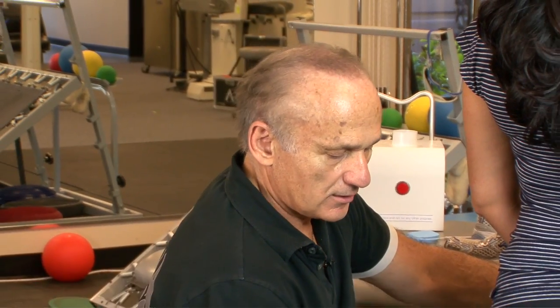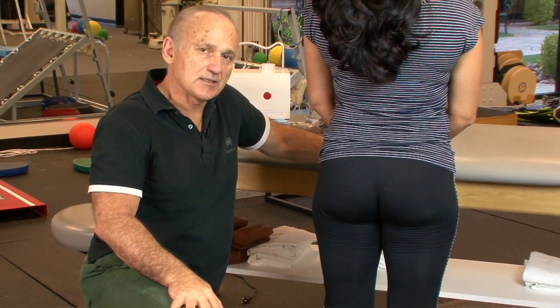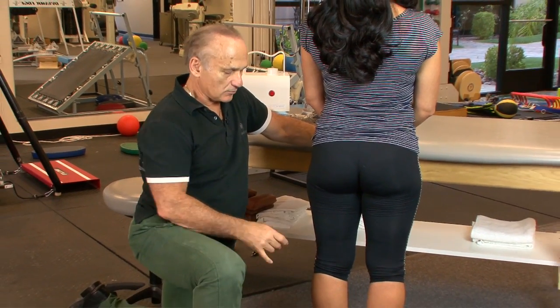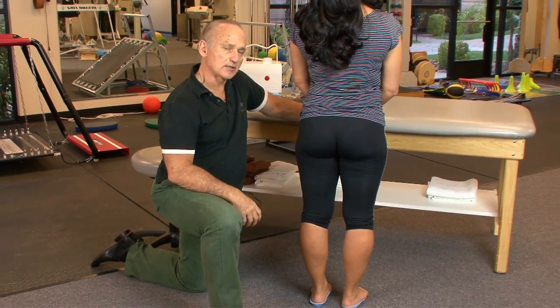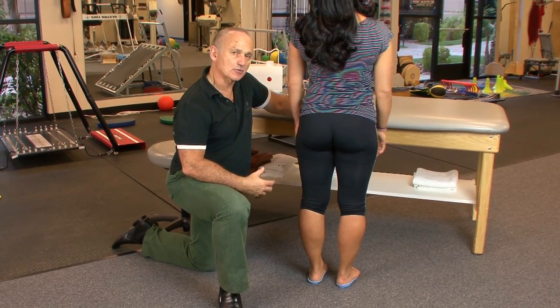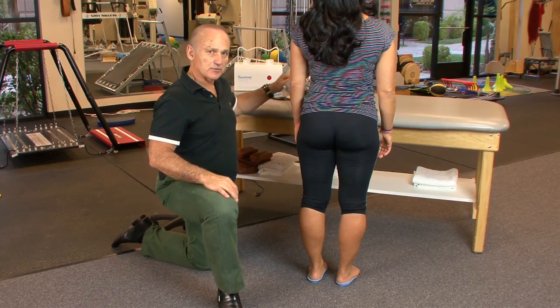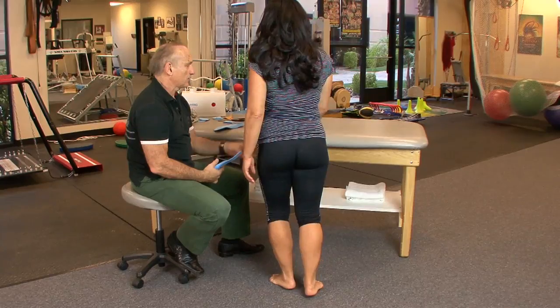We're trying to reposition the rear foot into better posture. The rear foot controls torsional movements — it acts as a torque converter from the low back through the hip, femur, and tibia, converting forces into three body-plane movements in the subtalar joint. That's what we're controlling with rear foot posting. It doesn't need a large amount of control, and in my experience we get great results with that.